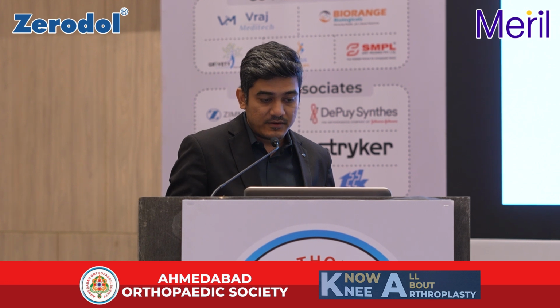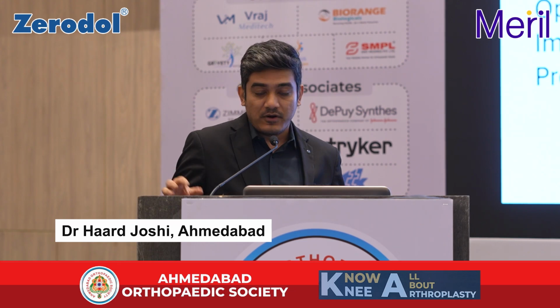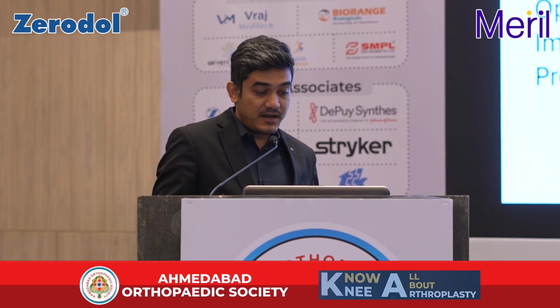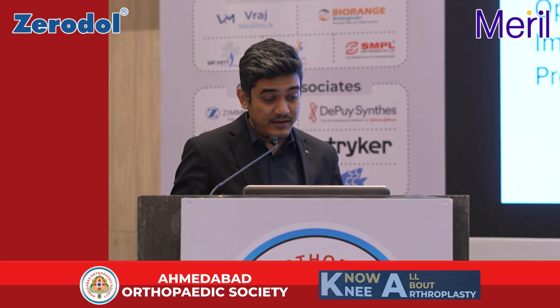My topic is on clinical evidence, but before that I'll be sharing some data also. So as already discussed by Manish sir, the medial pivot design seeks to emulate the knee's natural kinematics by restoring the natural motion and stability.